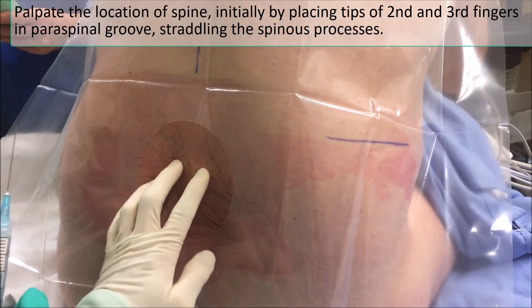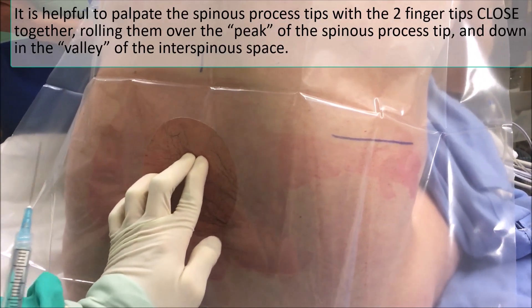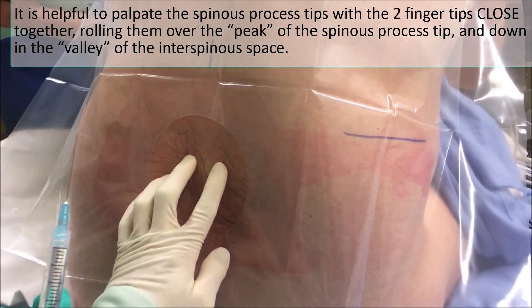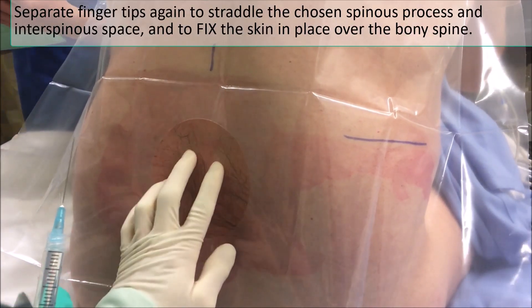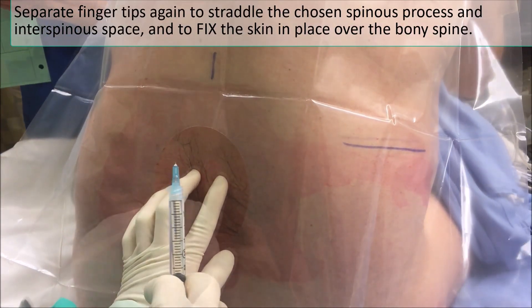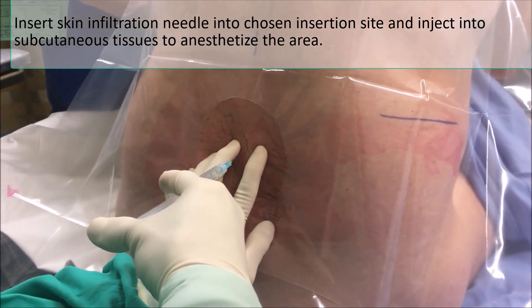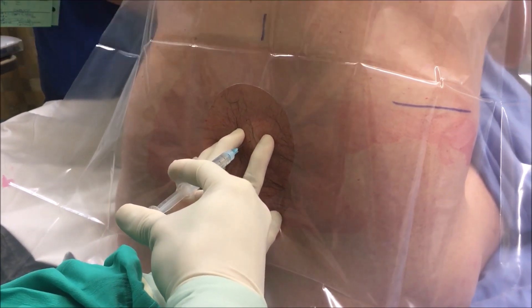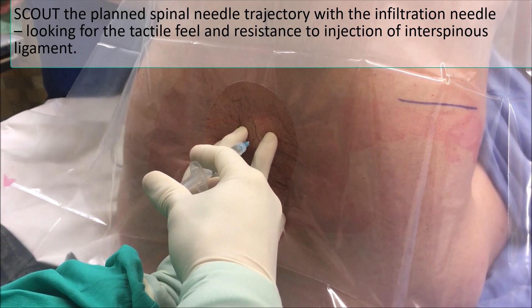I found this space just by rocking in the space between the two spinous processes and fixing the skin — this is actually the width of the spinous. One more time. This injection is just for the skin.